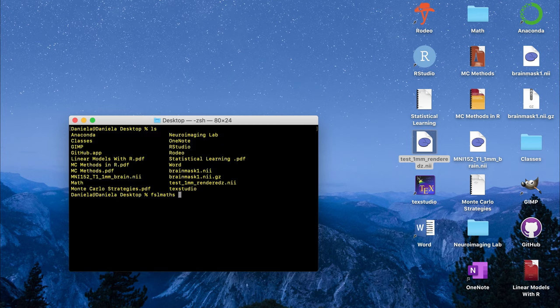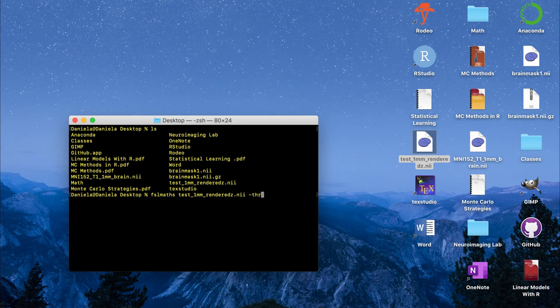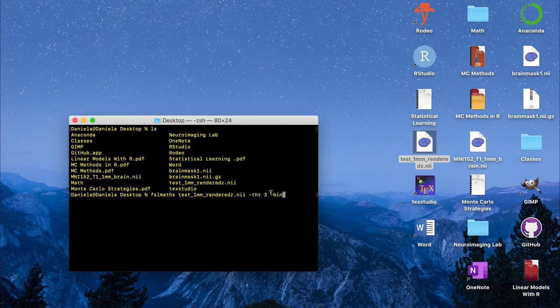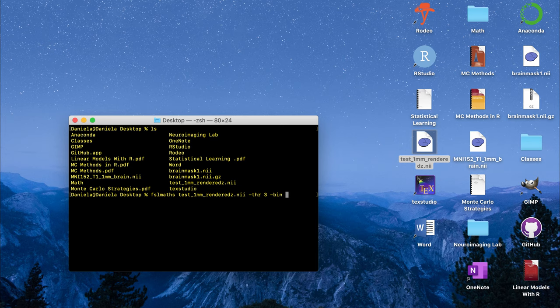We're again going to pass in the input nifty and so that's what I named it. Then I'm going to set a threshold. The threshold is going to be what gives you just the activated areas. Like I said before those fMRI maps were based on an activation threshold where it's considered activation if the intensity value is 3 or greater than 3. I'm going to set the threshold to 3. Then I'm going to pass in the -bin flag. You want to make sure you pass in the threshold first before the bin flag or else it won't work correctly. Then again I'm going to name it whatever output I want.